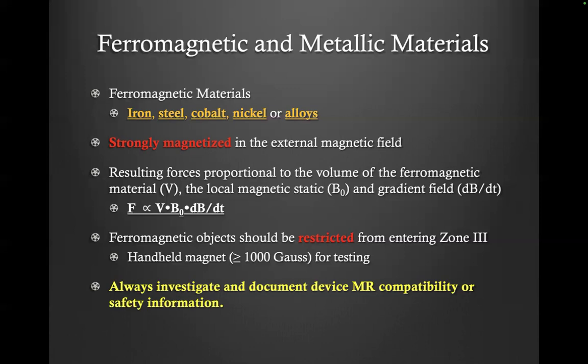The ferromagnetic object should be restricted from entering Zone 3. Even the control room, they should not go in there. We have a handheld magnet for testing. If you're not sure, or if you need to work on some new devices, then you need to talk to our staff very carefully, and we will schedule testing sessions with you, and we will talk to the vendors and document this device compatibility.